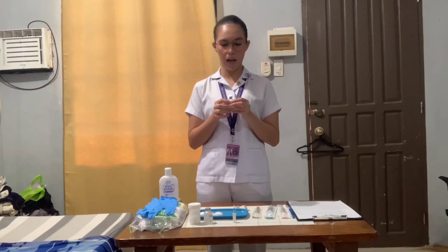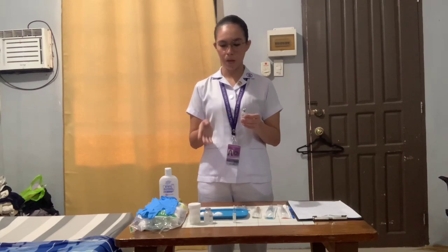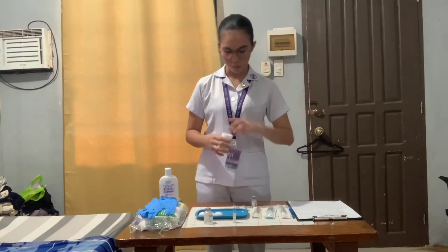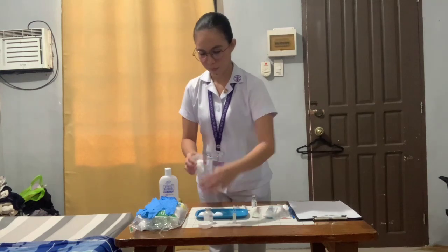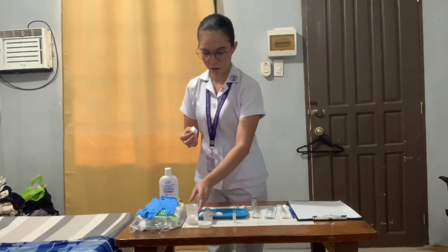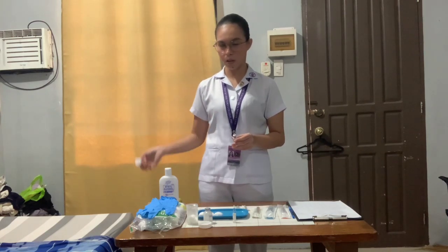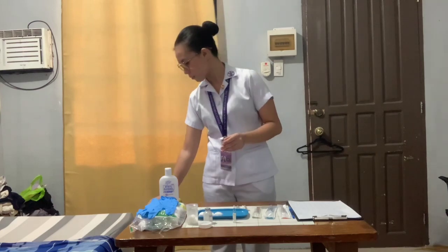But since I have here the rubber cap, I'm just going to wipe the rubber by rubbing it in a circular motion using the cotton ball soaked in 70% alcohol. Then after that, we are going to discard this cotton ball.